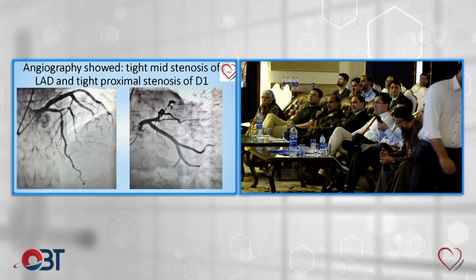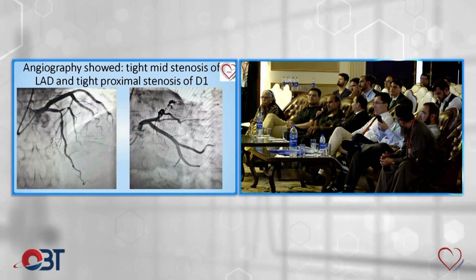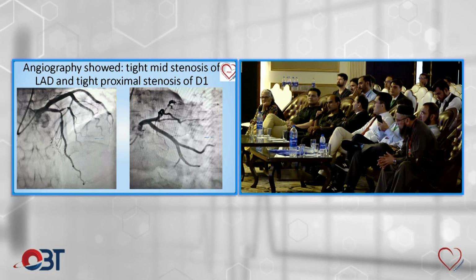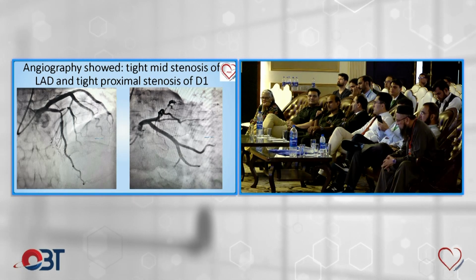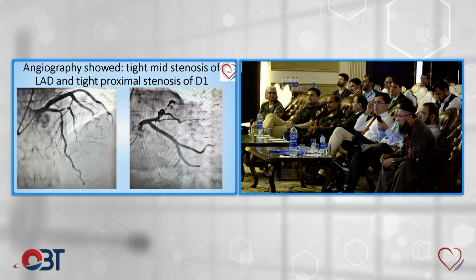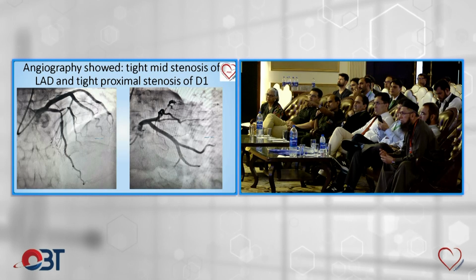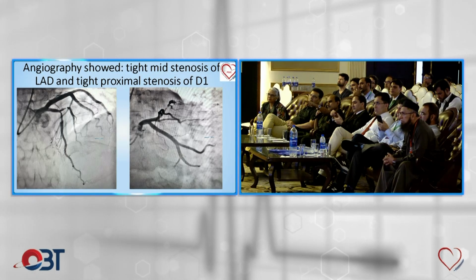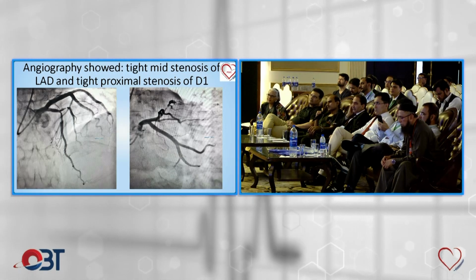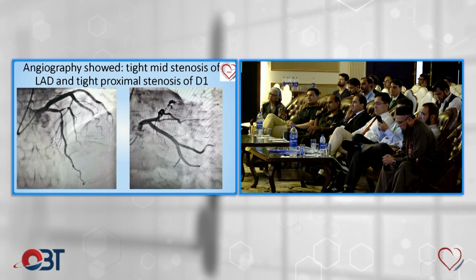Okay, in this case, I think the presenter had not shown the view of the IVUS plaque burden at the point of this bifurcation. So there was a significant plaque of 67% or around something, as far as I remember, it was above 65%. So there was huge plaque burden. You can see one clue if the IVUS is not added: when there is an origin of the septal 1 at this area, the diameter of LAD is huge. It's 3.5 or something, and the proximal is huge. So the actual LAD is a large vessel, and there was a huge plaque burden at that place.